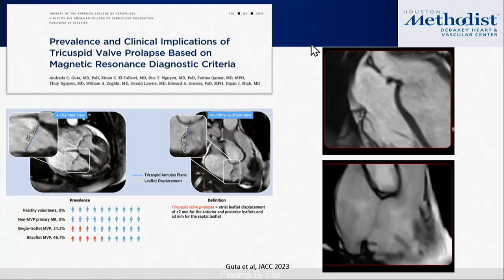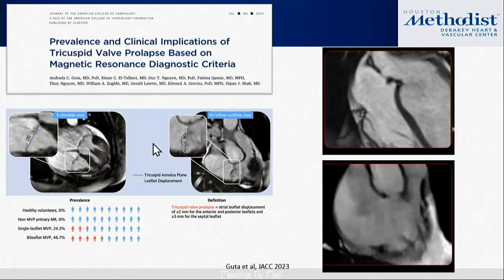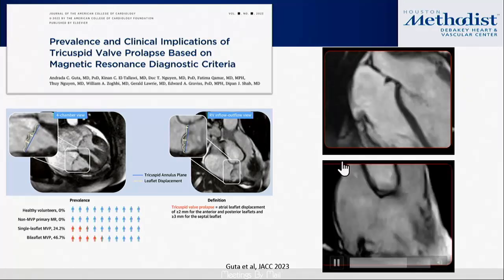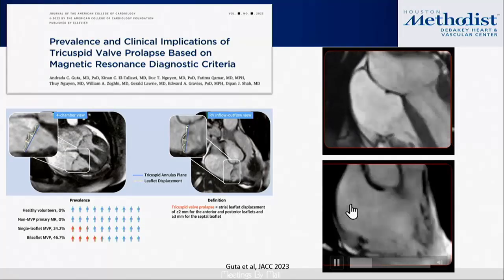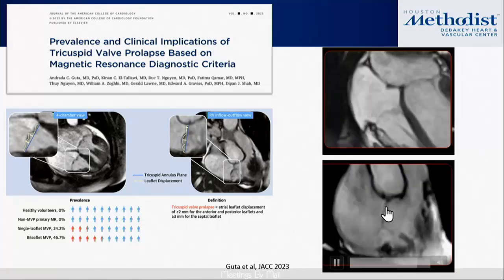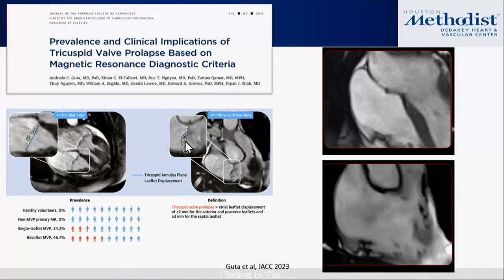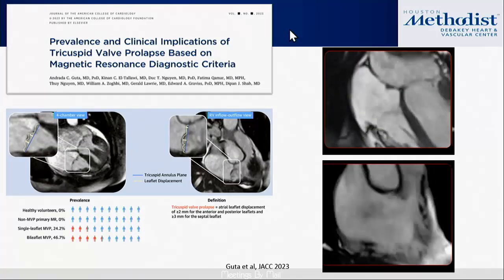I did mention one of the other forms of primary TR is prolapse. And this is one of the things that we can get from advanced imaging, particularly with CMR. You can actually measure the volume under the leaflets. So this is a concept both for the mitral and the tricuspid. When you have large billowing leaflets like a Barlow's, you actually have a volume that doesn't hit the RA and should be considered TR nonetheless, because it's extra volume that doesn't go forward and it helps to preload the right ventricle. So this non-regurgitant prolapsing volume is considered, and it's not usually huge, but it can be up to 30 mils or so. So it can be additive and quite significant.